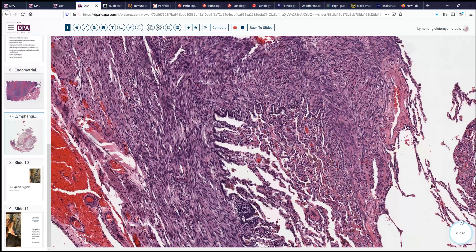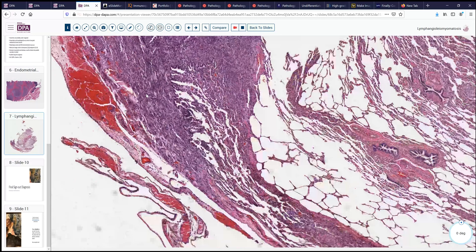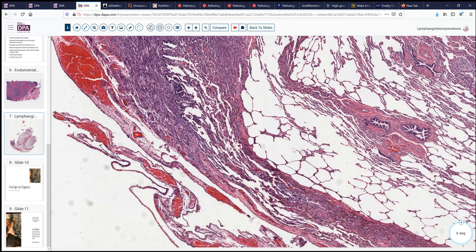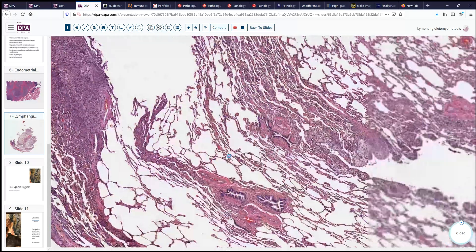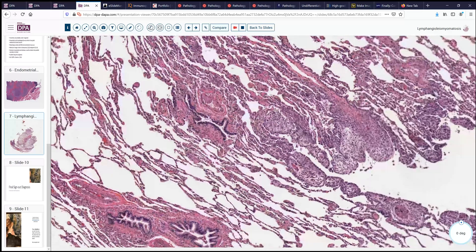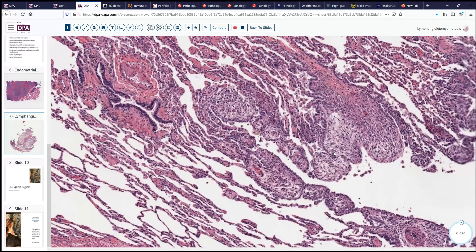Here we have a smooth muscle proliferation extending along subserosal spaces. It may involve interlobar septa, for example right here, and we see a little bit of that sort of proliferation along in this area as well. So this is a different histologic appearance, although the name can be somewhat similar — especially if you're new to the field.